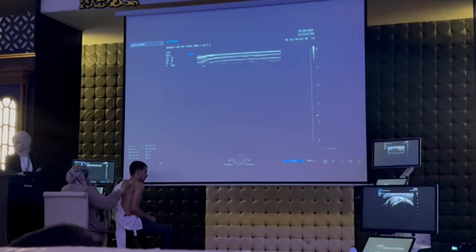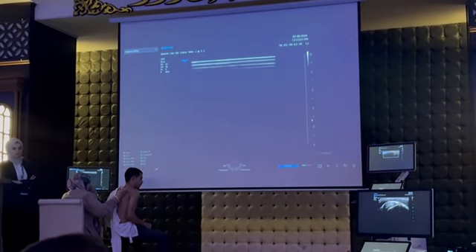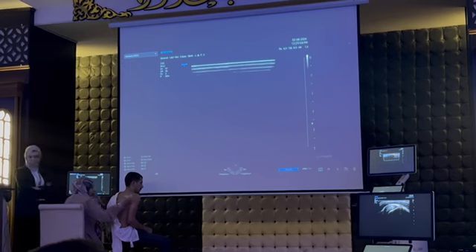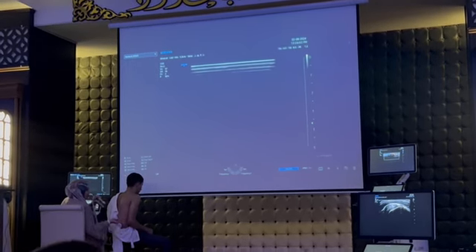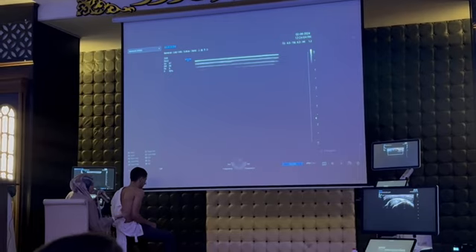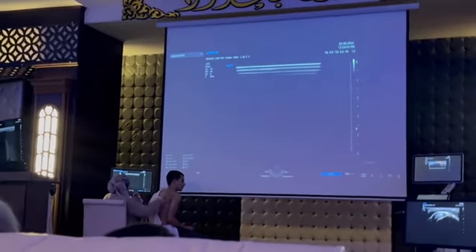Now, examination of infraspinatus. What's the action of infraspinatus? Its action is external rotation. So I do against its action by doing internal rotation. What's the internal rotation movement? By putting the patient's hand on the other side.